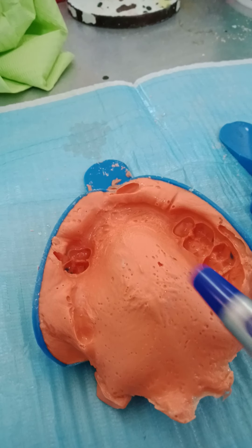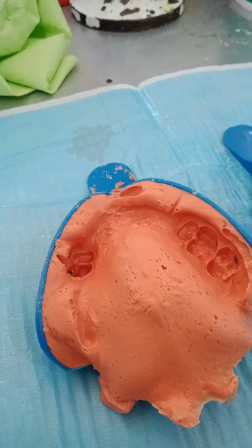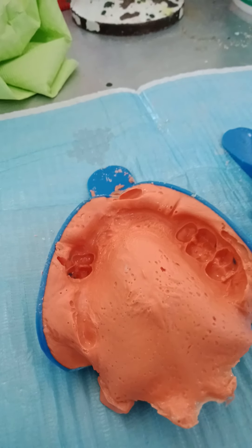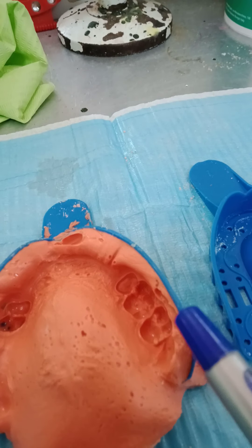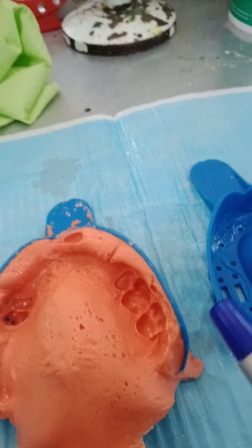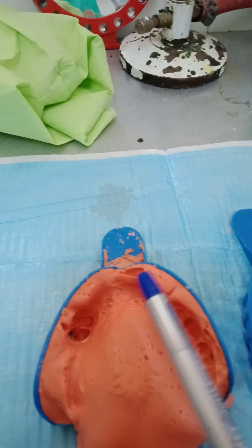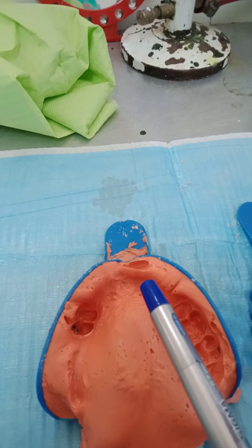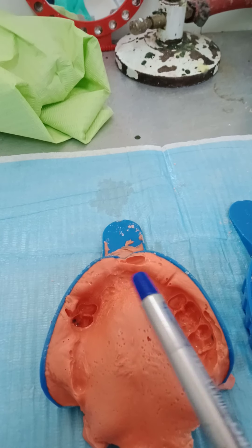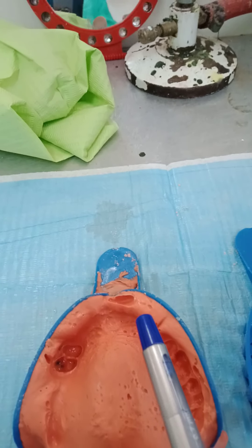I want to create a smooth surface here. I need a post-dam down. I'm demanding a special tray, but because we cannot do one, can I make this tray act as a special tray? The answer is yes. I modify this tray so it's more accurate around the sulci. I want to record this ridge very well in a compressed status, because this is an area of tissue compression.